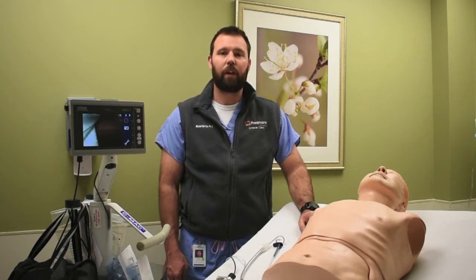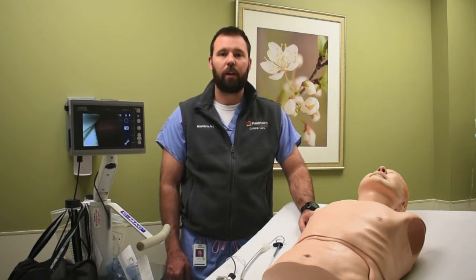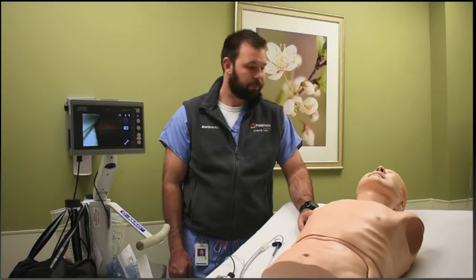Now, for the purpose of this video, we're going to assume that we have done an airway assessment, we have completed a pre-intubation checklist, and have come up with a plan A, B, and C, with video laryngoscopy being our plan A. So let's get to it.